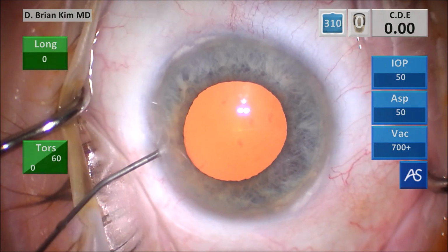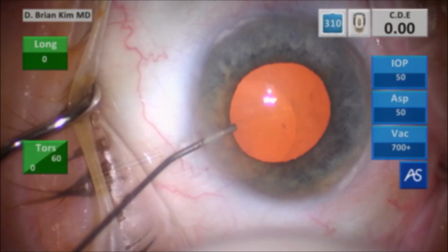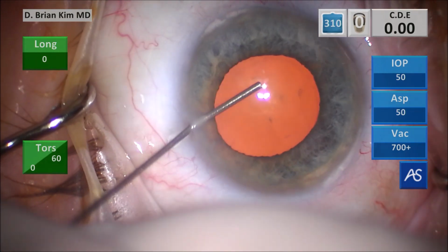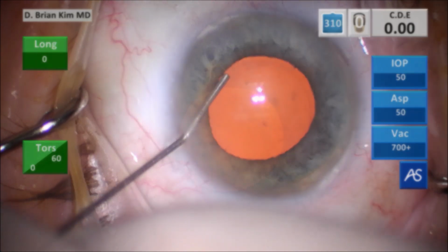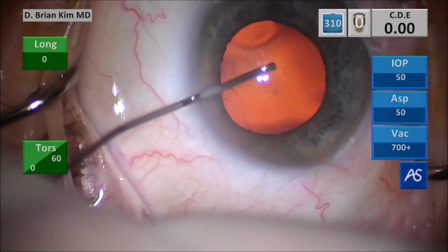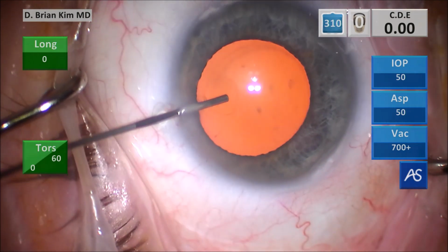This is some intracameral lidocaine and then some intracameral epinephrine. My staff must have suspected that this patient may have IFIS, and so we went ahead and placed some epi. I inject some dispersive viscoelastic to expand the pupil and flatten the anterior capsule.